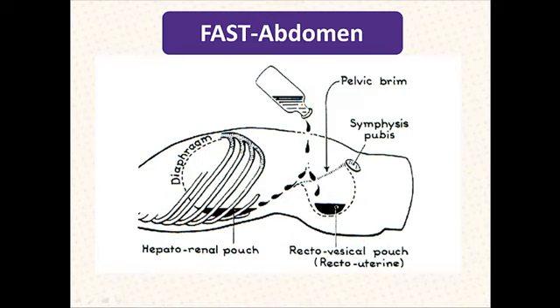When blood is introduced into the peritoneal cavity, presuming there is no restriction to flow, it will move downhill, so to speak, and accumulate in the three most dependent parts of the abdomen. In the supine patient, we look for blood in any one of these three potential low spots. For blood originating in the lower part of the abdomen, this corresponds to the pelvis. For the upper abdomen, this corresponds to the right upper quadrant and the left upper quadrant. Let's take a closer look.